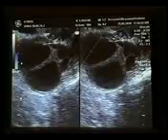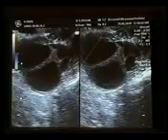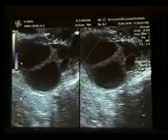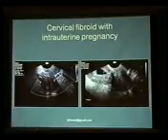Ovaries are also scanned, and sometimes you see large follicles in hyperstimulated cases. Whenever hormones and clomiphene are given, ovaries may become hyperstimulated and can have a lot of cysts. In this case, this is an intrauterine pregnancy and there is a large cervical fibroid.